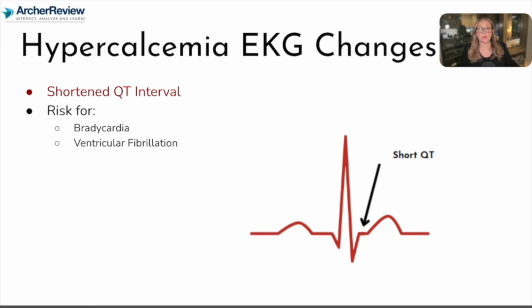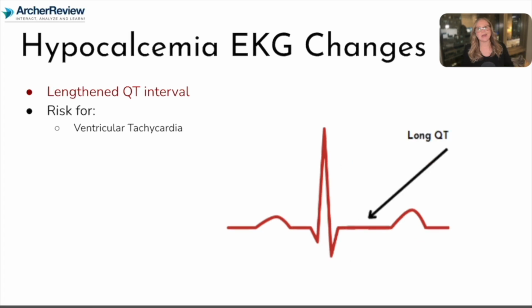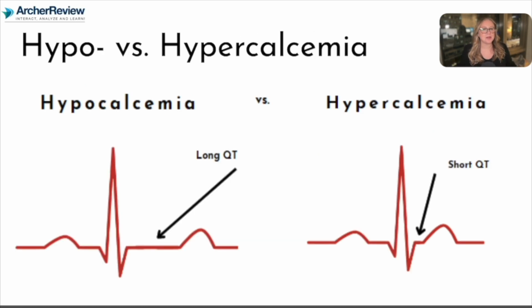If our clients don't have enough calcium, however, with hypocalcemia, exactly the opposite happens. The QT interval lengthens. And with a prolonged QT, we are worried that the client could go into VTAC. So, comparing hypo and hypercalcemia, low calcium, we get that long QT, we're worried they could go into VTAC. And high calcium, we get that short QT. I'm going to be more worried about bradycardia and potentially going into VFib.